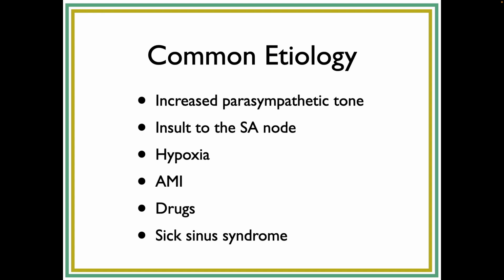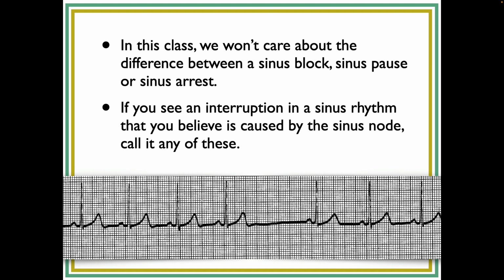Okay, now in this class, I've just told you what a sinus block is and a sinus pause and a sinus arrest. And the truth is, clinically, whether it's a sinus block or a sinus pause, it makes no difference. Plus, they're kind of hard to tell apart, because I gave you the rules: they come in at the right time, they slow down, but a lot of times it'll be in the middle between the two. So I don't want you spending any time trying to decide if it's a sinus block or a sinus pause or even a sinus arrest.